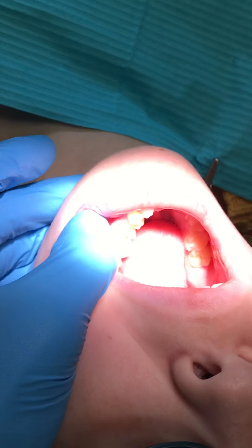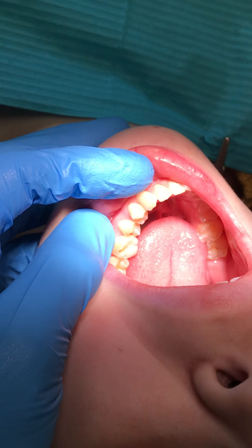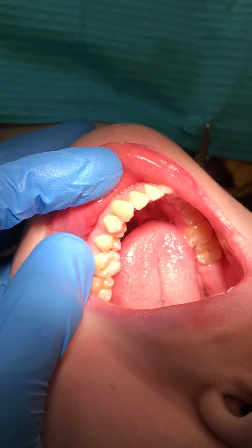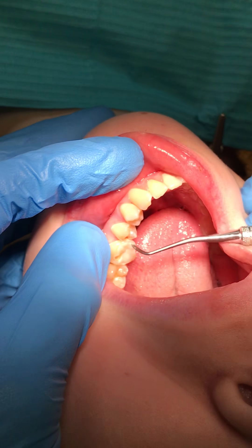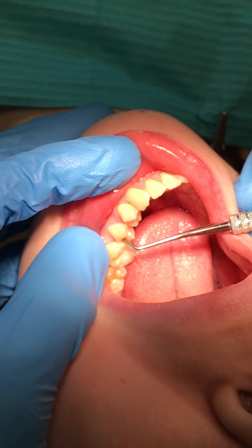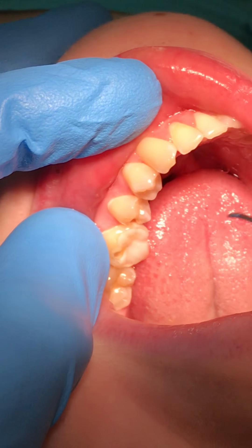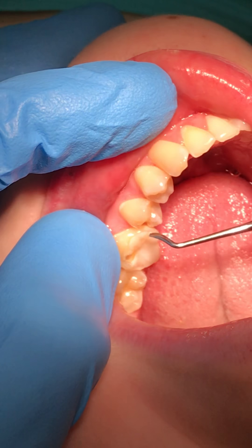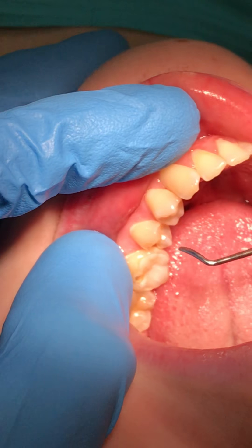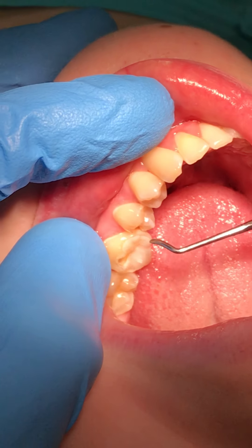We've got some incipient lesions — this right here on the mesial of number 19. I'm not sure if you can see it, this little white spot right here. It shows up well on the x-rays as a radiolucency, but it's not past the DEJ, so I'm going to leave that alone. We're going to make sure we get that thing situated — Jessica's going to floss with a little fluoride toothpaste.